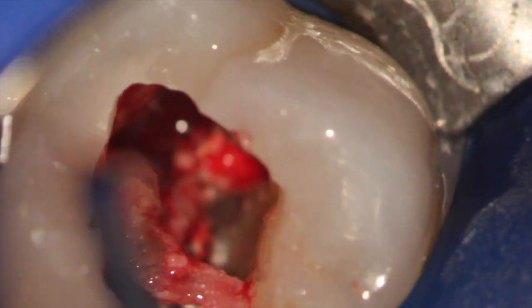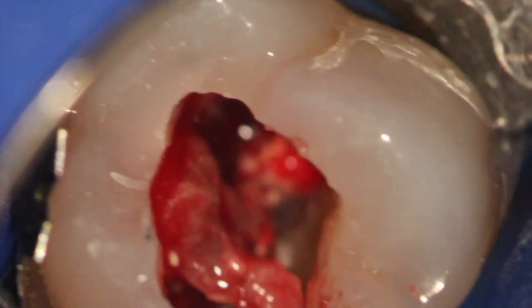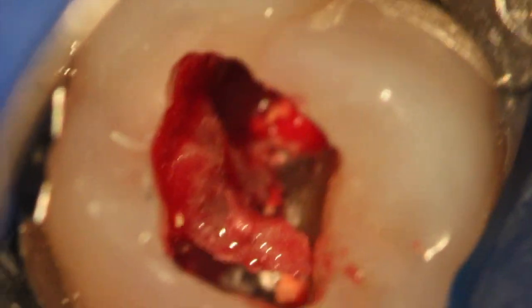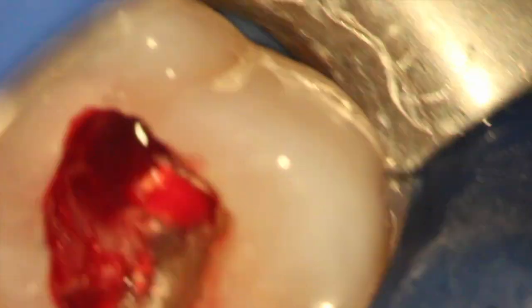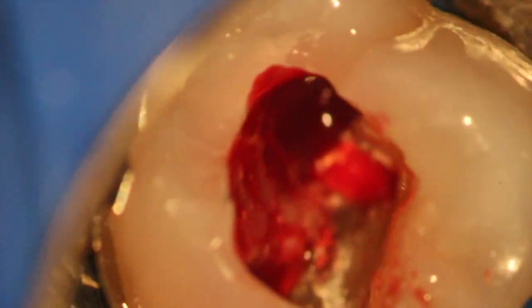You're wondering why I'm even doing this. This looks pretty exciting, but our patients want to keep their teeth. Typically we try to do nothing on these resorptive cases and just let the body naturally do its thing, watching them over time. But when they become symptomatic and a decision has to be made, oftentimes our patients want us to try to do something. And this is today the best we have.